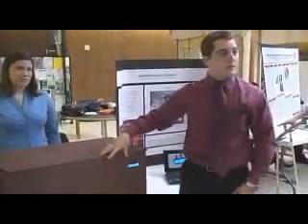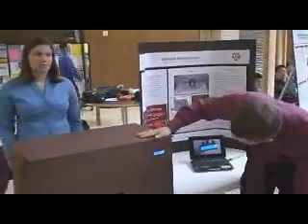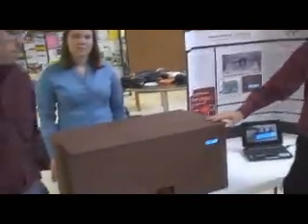Okay, Stephen, I think we're getting lost with all of those setting modes. So let's try to put it into action. Okay, yeah, do you mind if we open it up and look at it? What's going on the inside here?